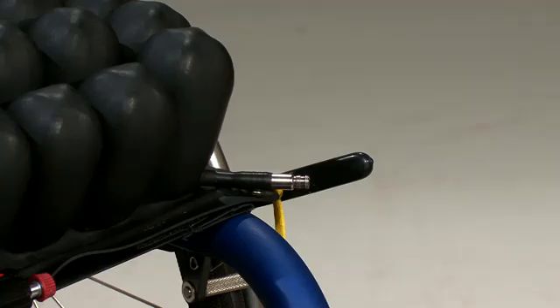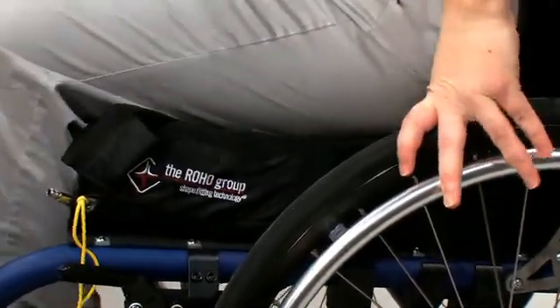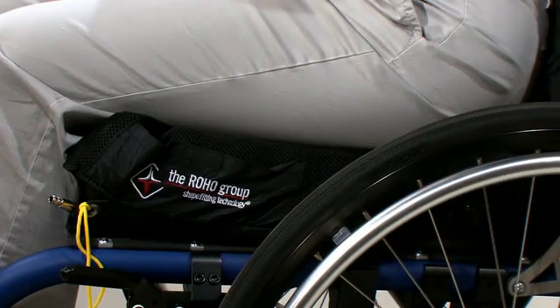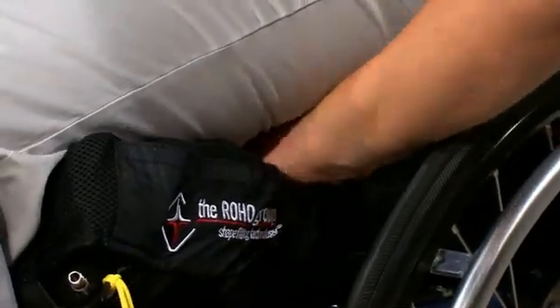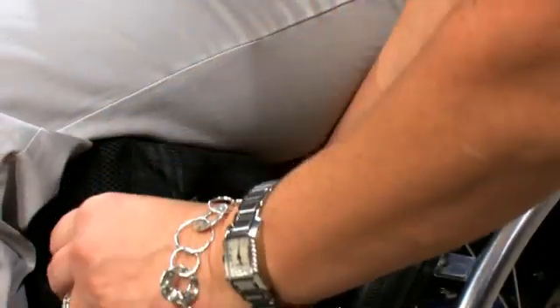Remove the pump. After overinflating the cushion, have the individual sit in the chair, making sure the cushion is centered underneath. The individual should be seated in their normal sitting position. Now slide your hand between the cushion surface and the individual's bottom. Lift their legs slightly and feel for the lowest bony prominence. Then lower their leg to a sitting position.